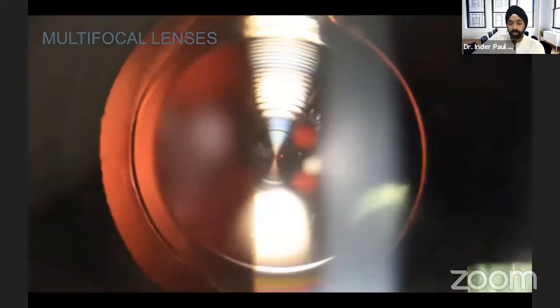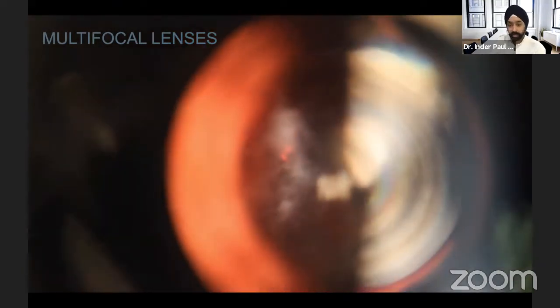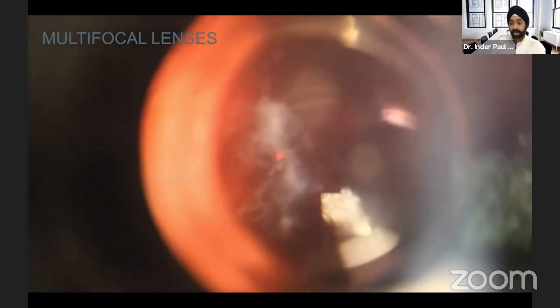And then I'm going to go ahead and show you multifocal lenses. One of the biggest benefits I've seen are patients who have premium lenses and are miserable afterward. People have a hard time with reading because of these floaters. And so even through a multifocal lens, you can get great efficacy with this laser. And I tell you, these are the patients who I've gotten referrals from, where they're having a difficult time reading J3, J5 because of the floaters.